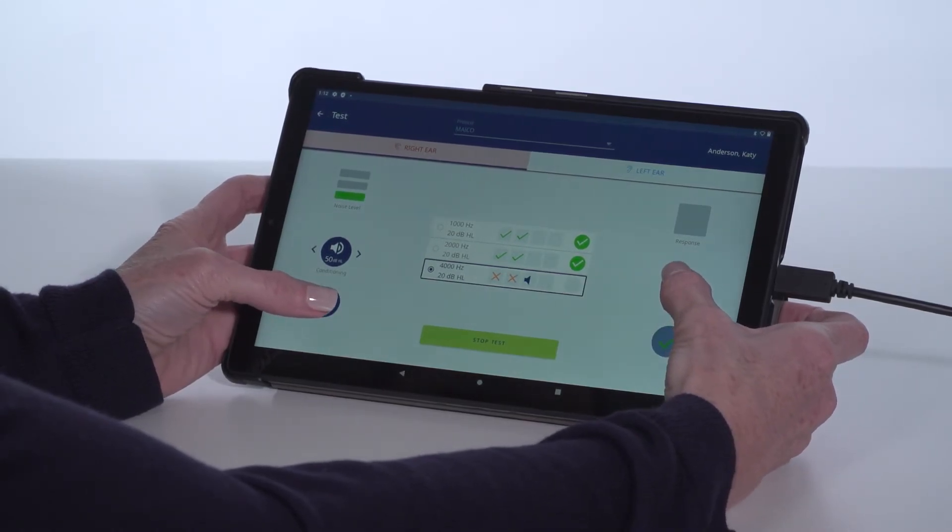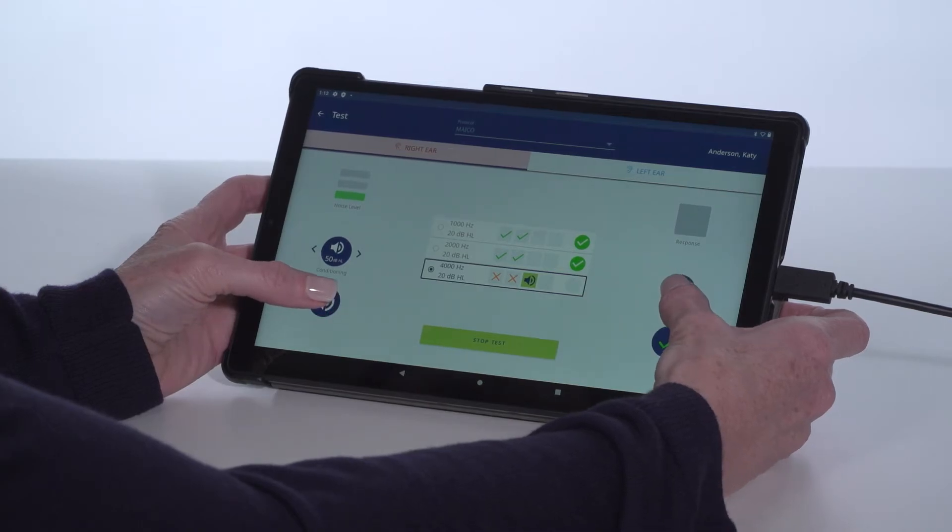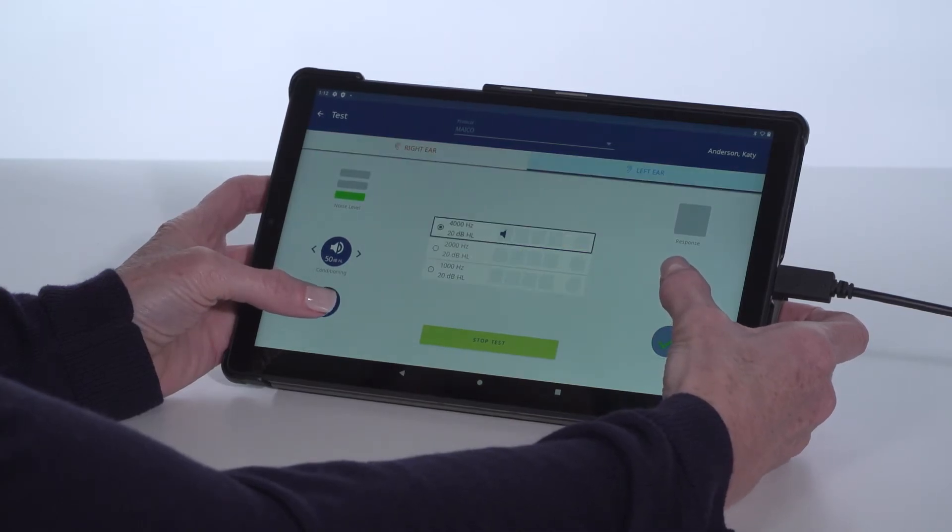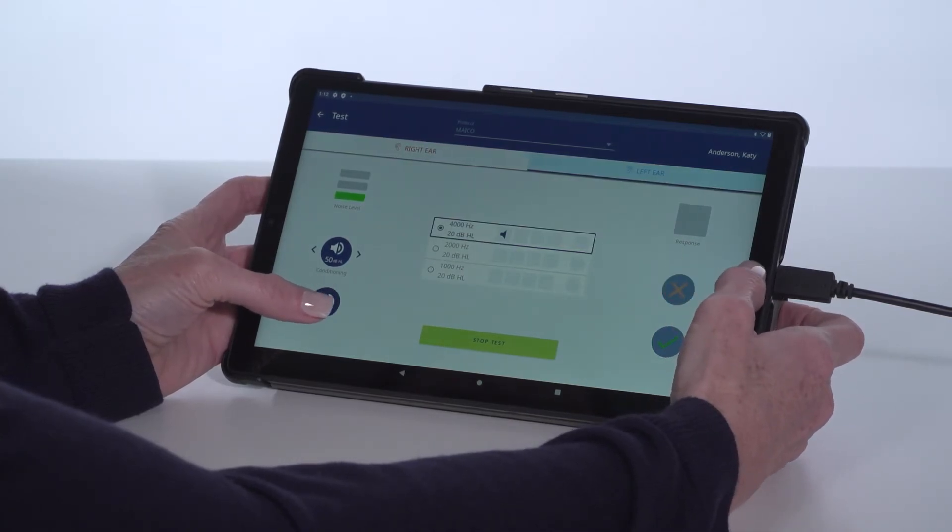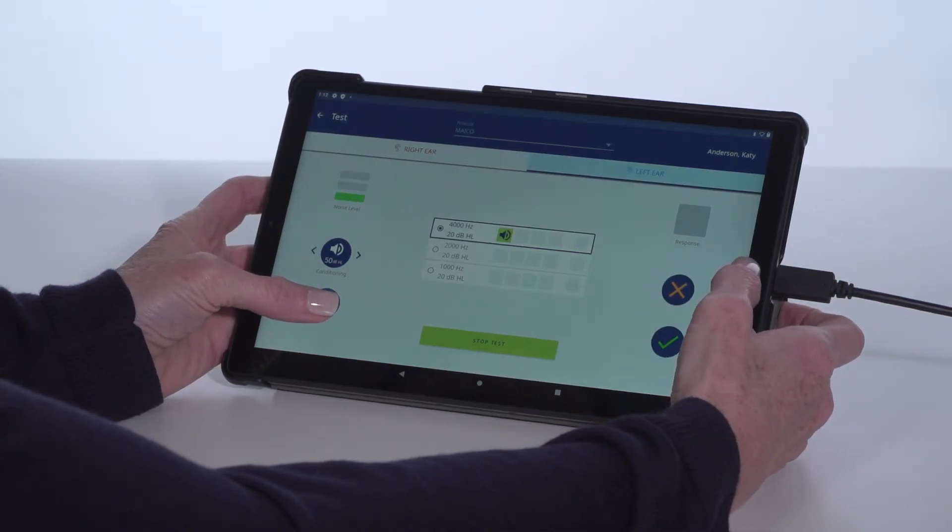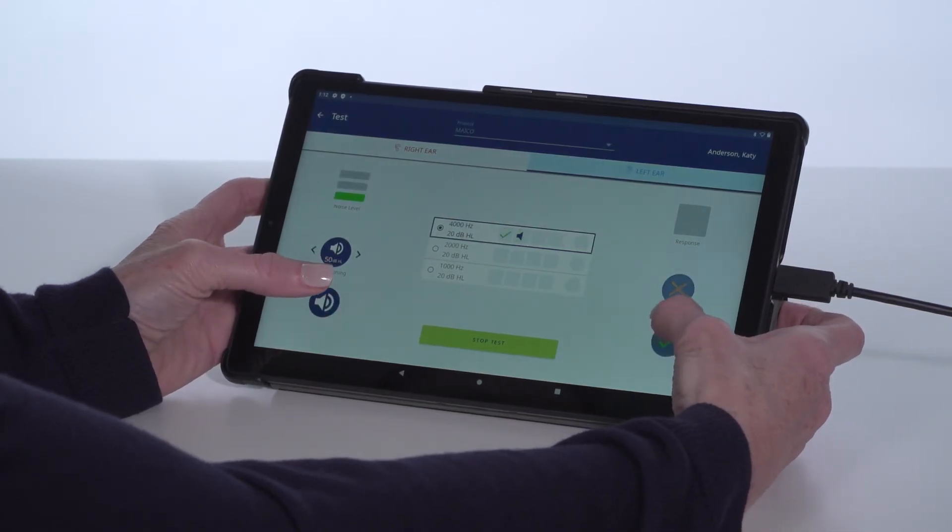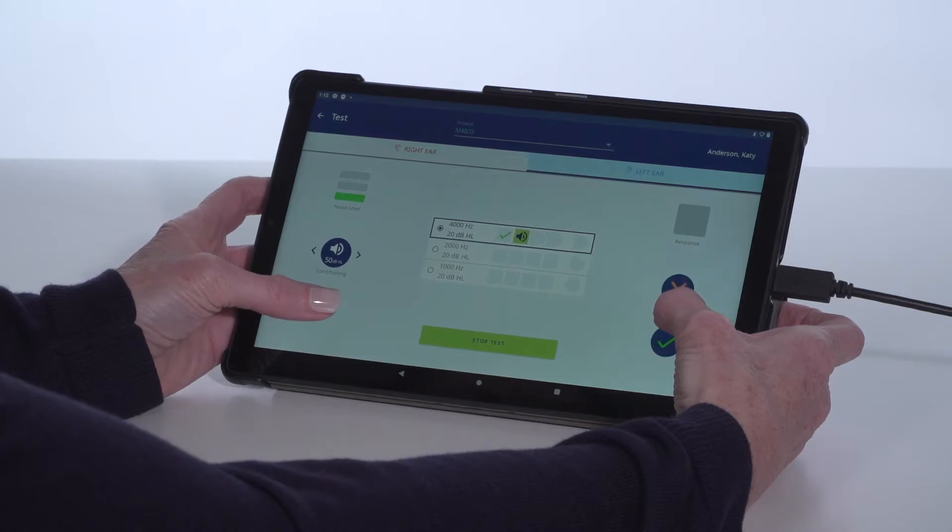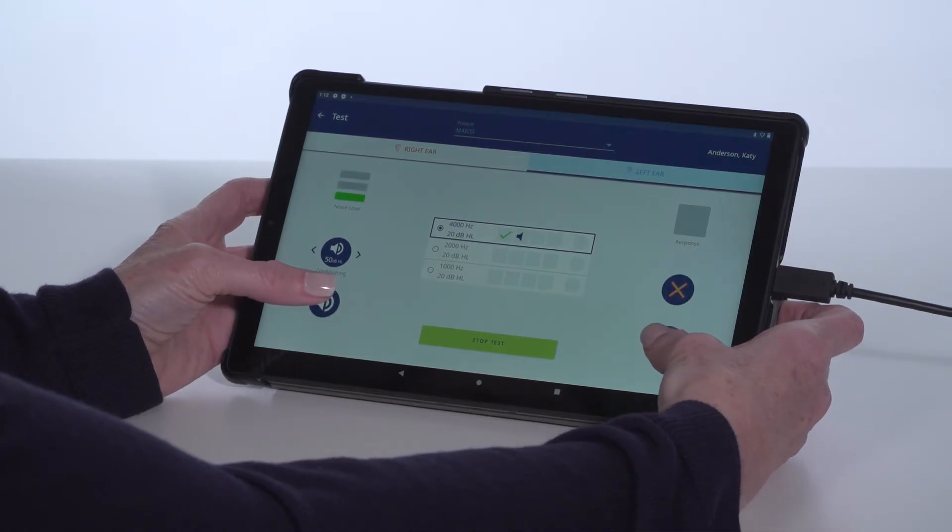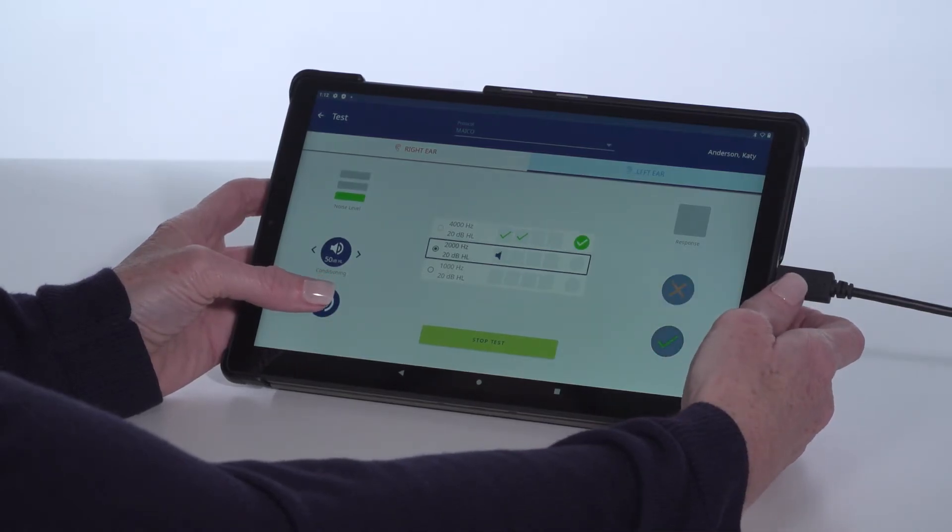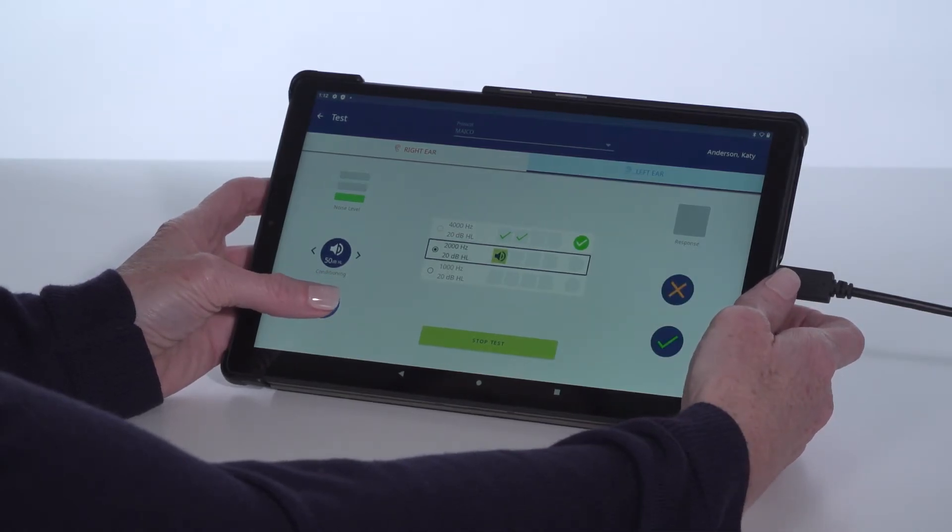Progression through the test is automatic as the protocol will automatically move to the next frequency when the criteria is met and will switch to the second ear when all frequencies are completed.